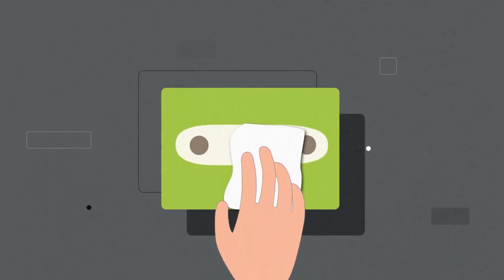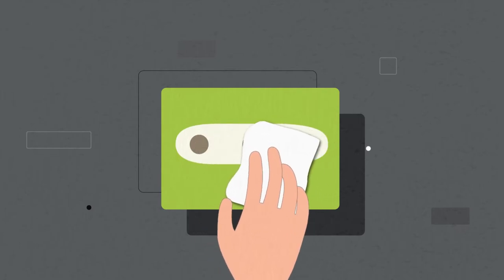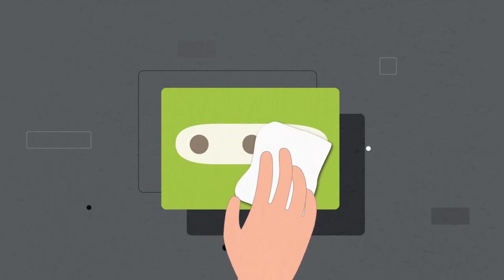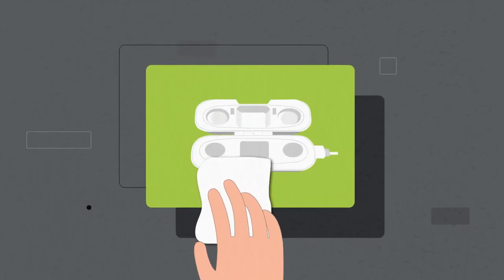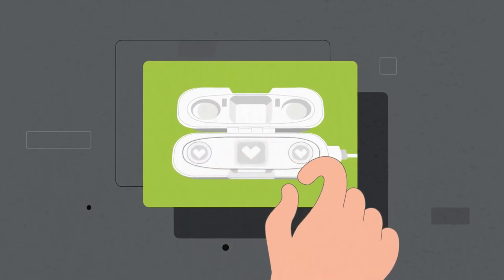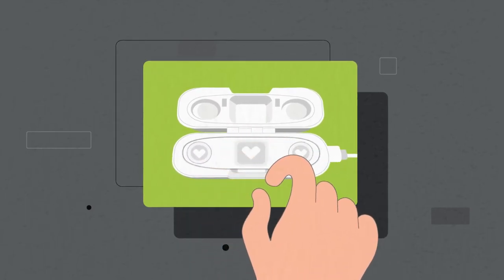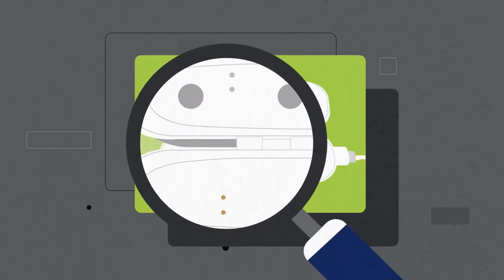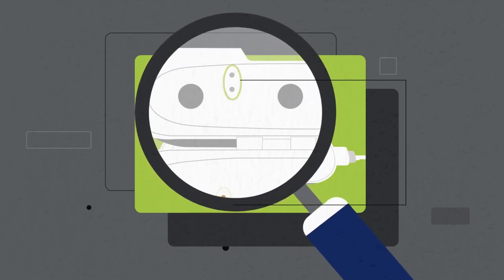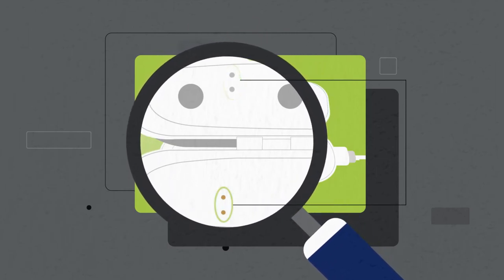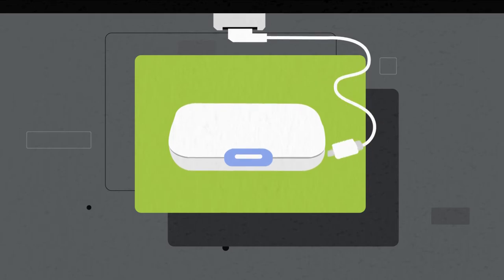Once removed, please clean the back of the sensor with the alcohol wipes provided. Once cleaned, place the sensor inside the white charging case. The copper pins should be aligned with the two small circles on the back of the sensor. Close the case with the sensor inside and plug it into the wall.